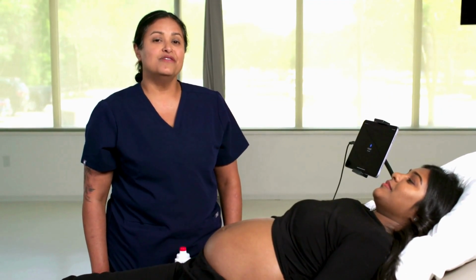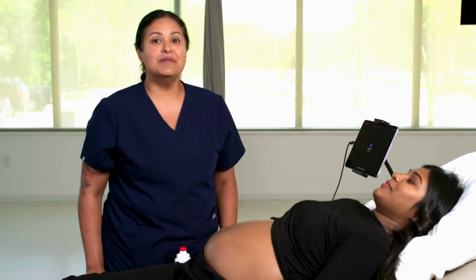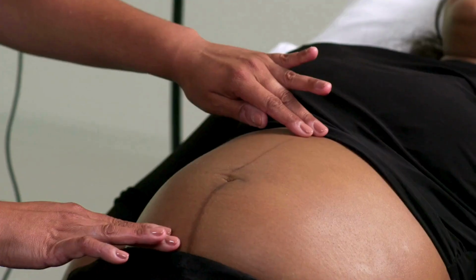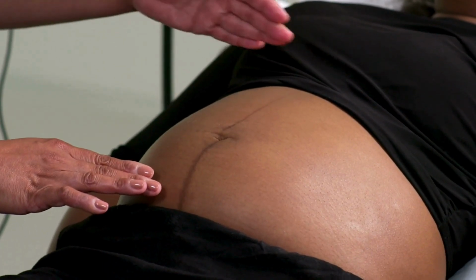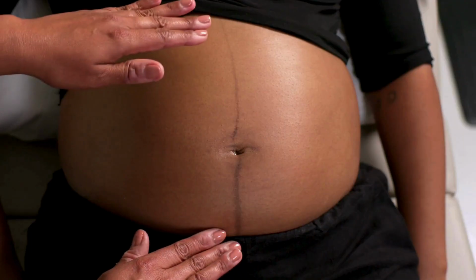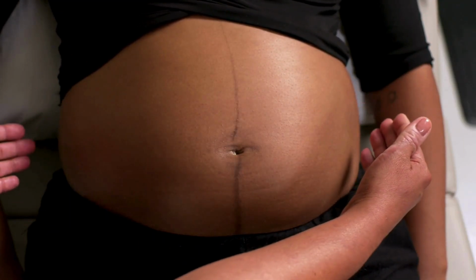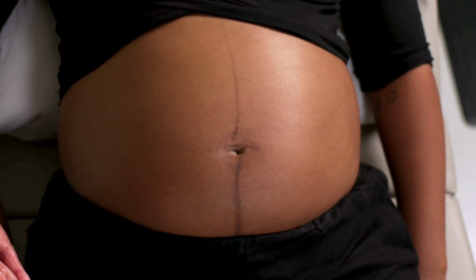Let's get started. First, position your patient in a semi-recumbent position as shown. Then, adjust clothing to allow craniocaudal scanning of the entire pelvis and abdomen, from the suprapubic to subxiphoid regions, and then lateral scanning to both anterior axillary lines.